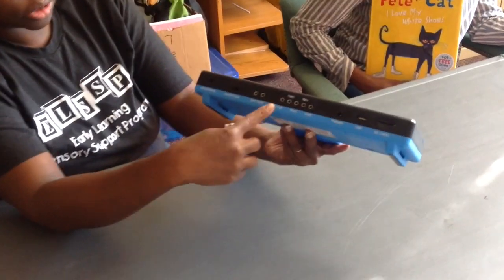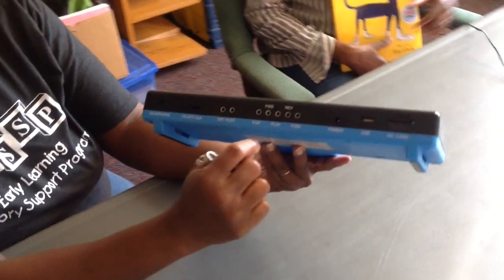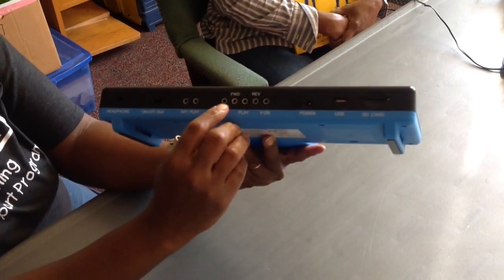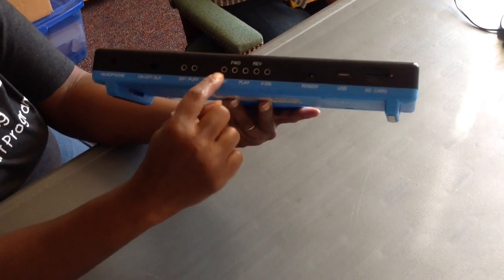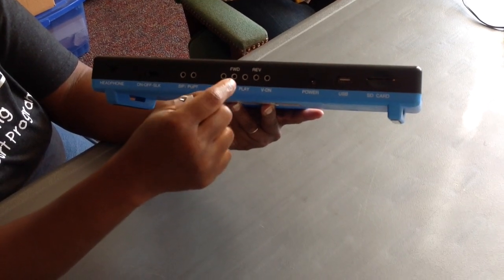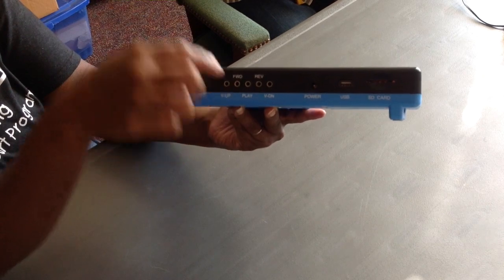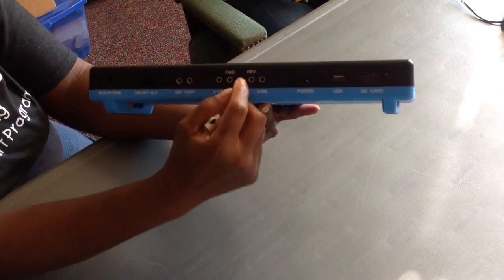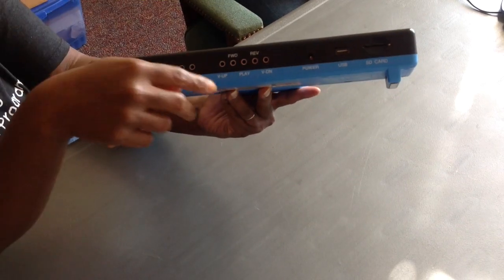And on the back of the Joy Player, you have like these different slots that you can put a switch in. You have one for like the fast forward, the rewind, the play, and then these are the two, like the volume up and the volume down. And if you put a switch into either one of these slots, that switch is going to control that particular function. So if you put a switch in the play, it's just going to control the play button if you use the switch with it.